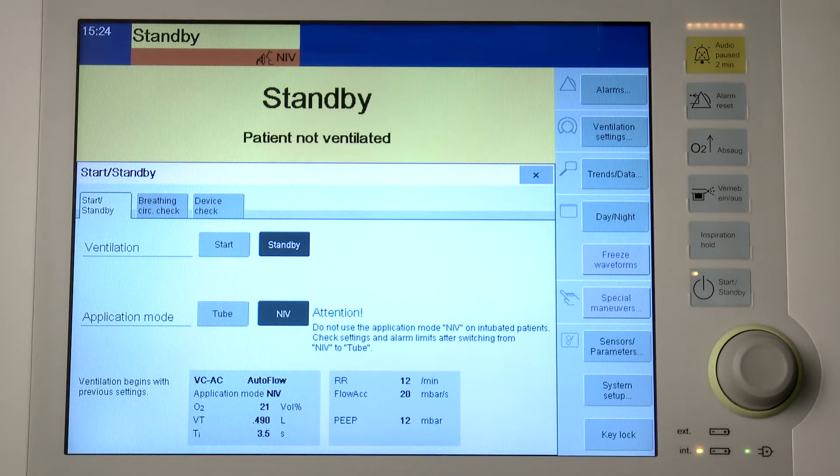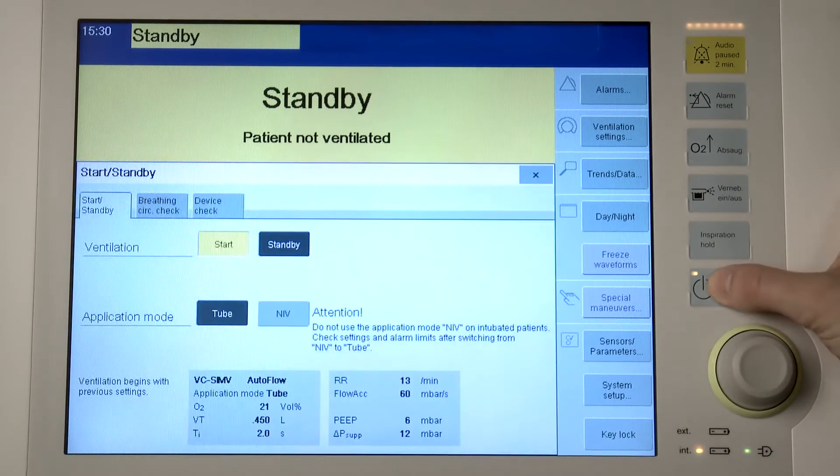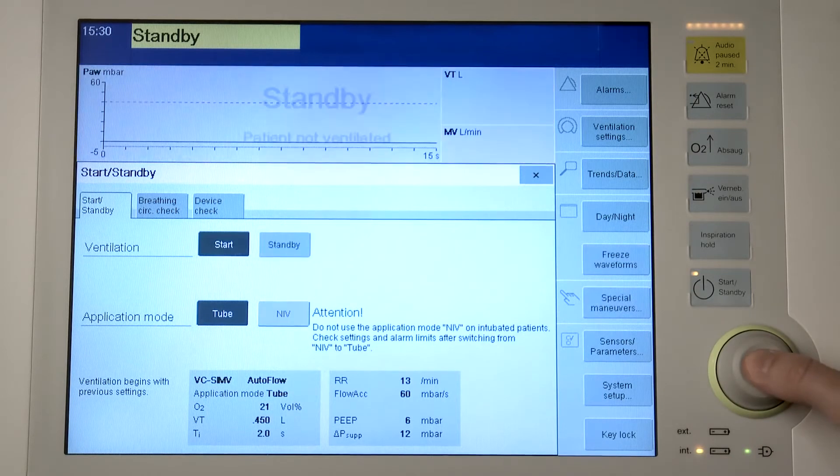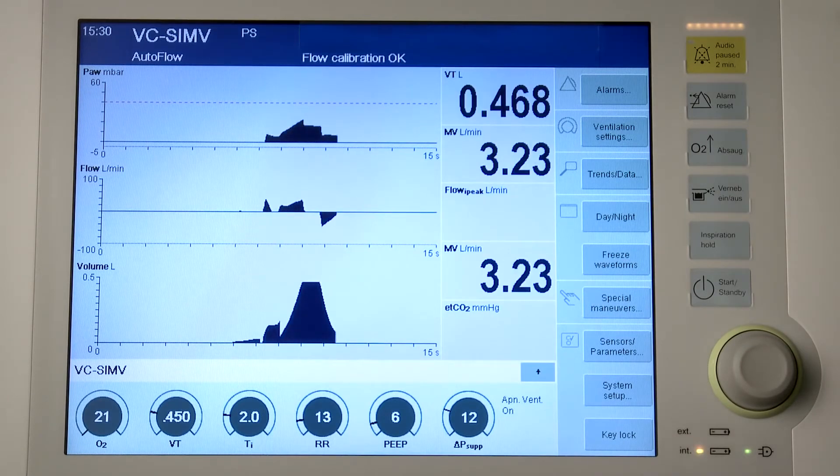In the NIV application mode, an NIV symbol is displayed in the header bar in an orange area. To start ventilation, press the start standby key. Savina 300 opens the start standby dialog window. The start standby page appears by default. Confirm start of ventilation with the rotary knob. Savina 300 starts the therapy with the set ventilation parameters. The main screen for ventilation is displayed.